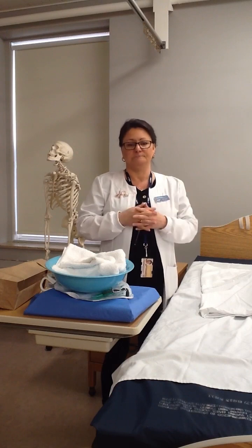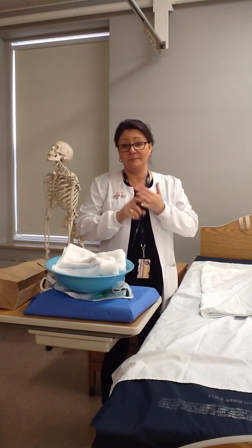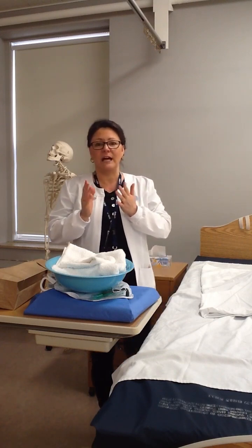And so for starters, I'm going to check the doctor's order for all of the specifics associated with this catheter insertion for our male patient, Jesse. I want to know the type and size, perhaps, and how long he or she wants it to be inserted, and so on. So I'm going to make sure I have a doctor's order. And then I'm going to check the patient's chart.